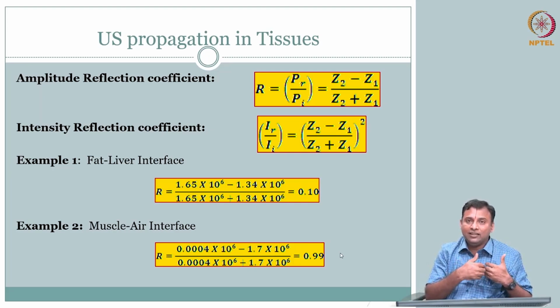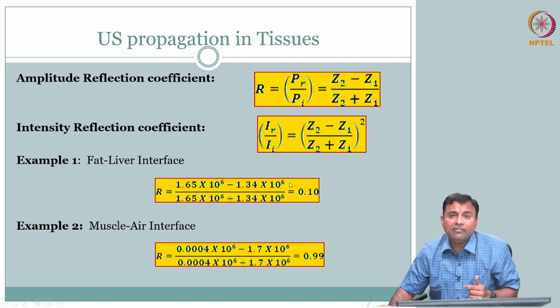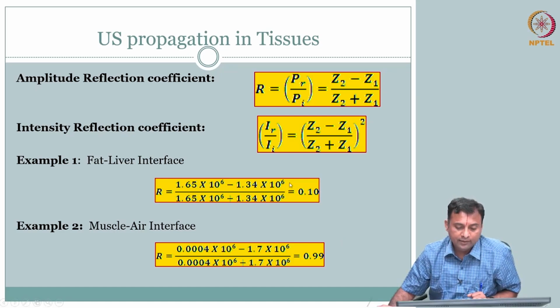This is the reason when you go towards the lungs, inside is air, outside is some other soft tissue. So you are not able to penetrate the lung. This is a very practical constraint that you will encounter.